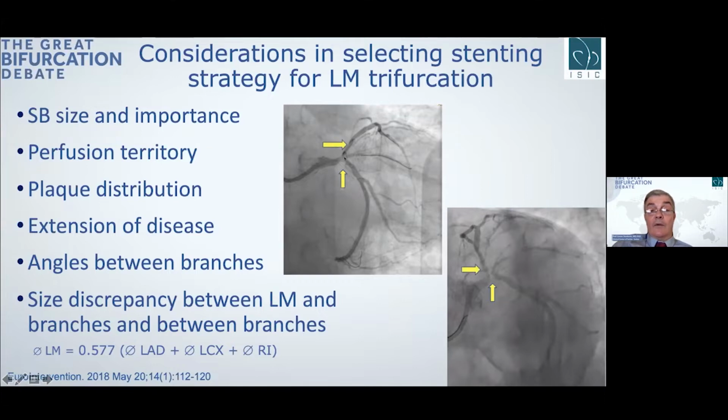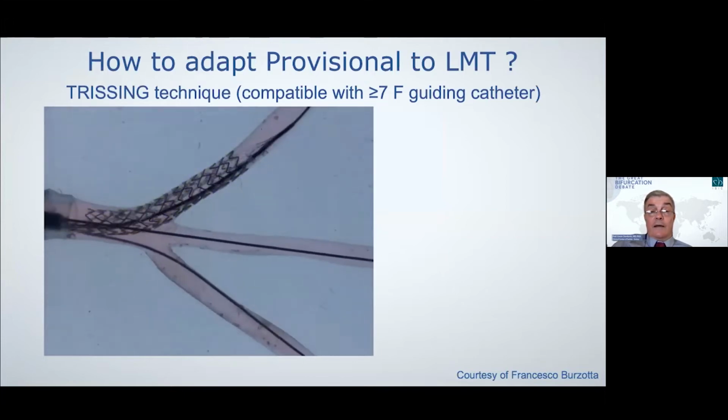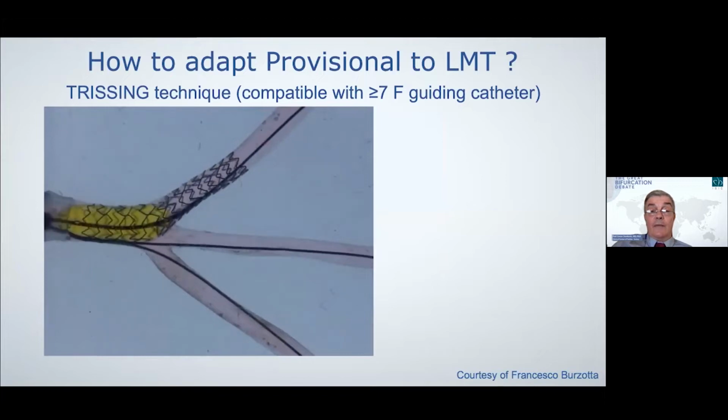And we also see that there is diffuse disease not only in the ostium but also in the whole proximal part of the LAD. And we understood from the IVUS pullback in both arteries that we also have a very huge plaque burden and partial calcification inside the distal left main. So in my interpretation, I also vote, in general, for efforts to limit the amount of metal.